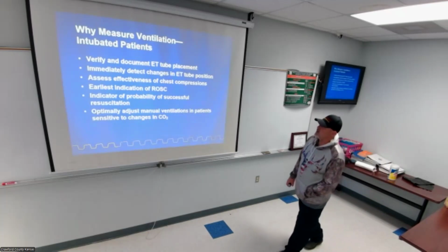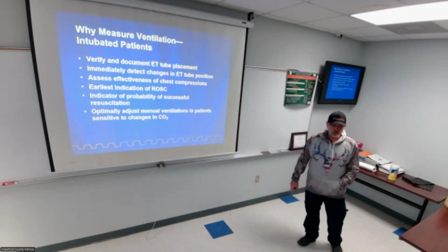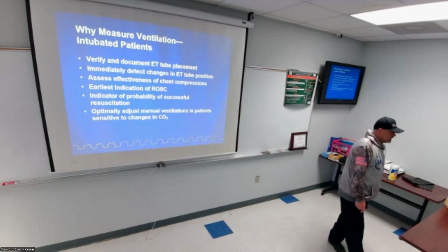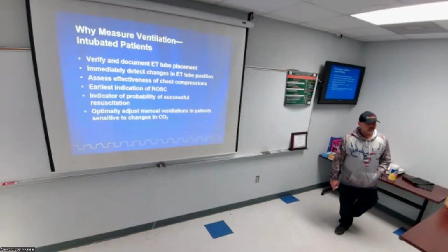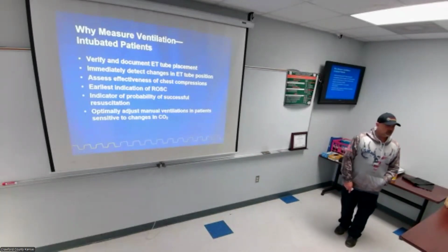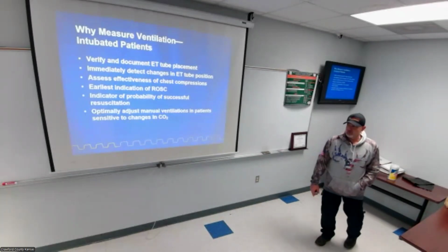So, why measure ventilation in intubated patients? Verifies and documents ET tube placement. The number one thing that we have is that waveform that lets us know that our ET tube's in the correct placement. Whether it be a little shallow or a little deep, you're still going to get a waveform. You're still in the trachea. That's what we want.